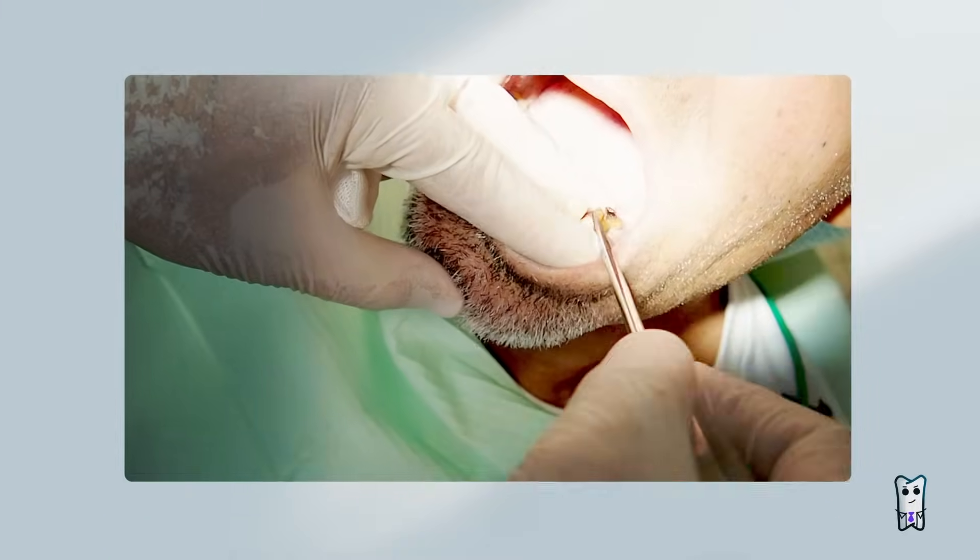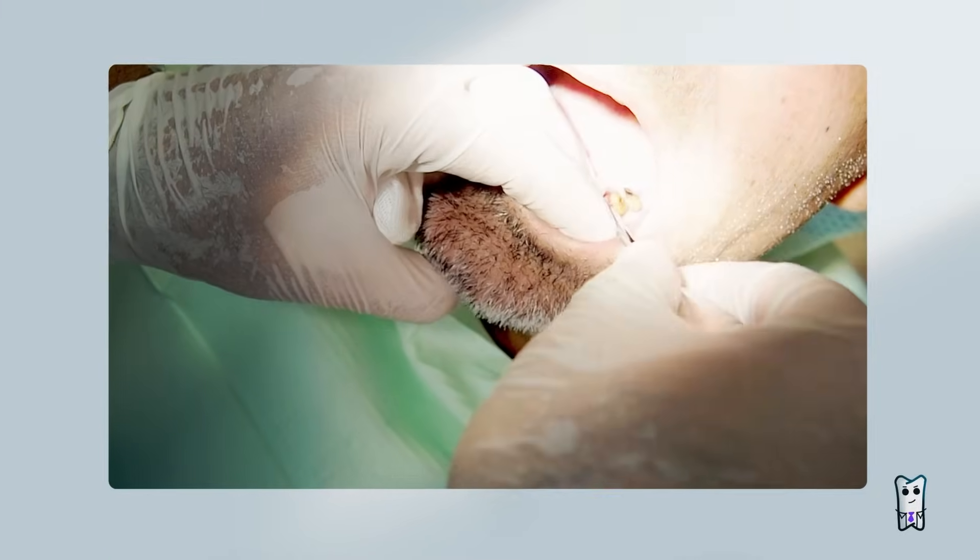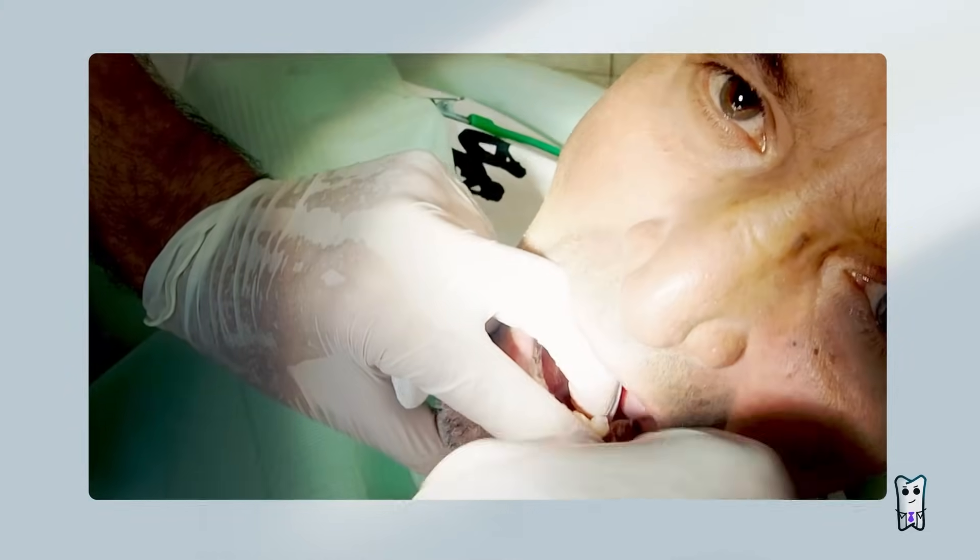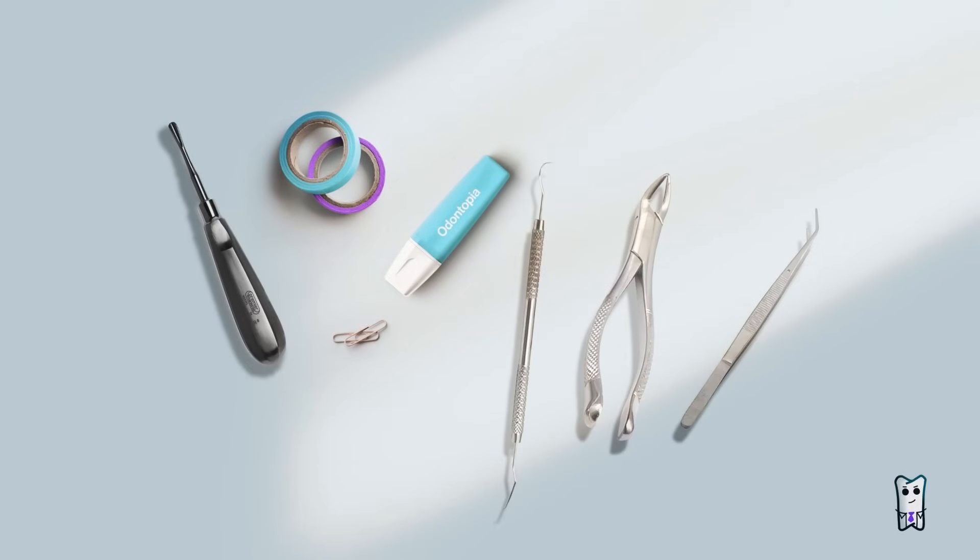Quick tip: if you are extracting multi-rooted teeth with separated roots, luxate one of the roots and when it's already luxated, don't extract it, but use it as fulcrum for the other roots to be luxated. And then extract them both.